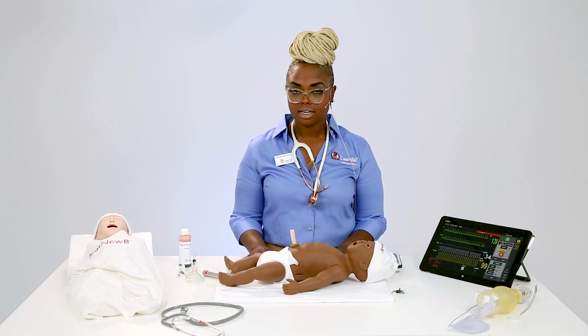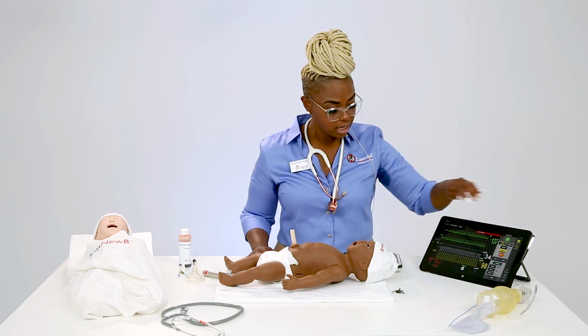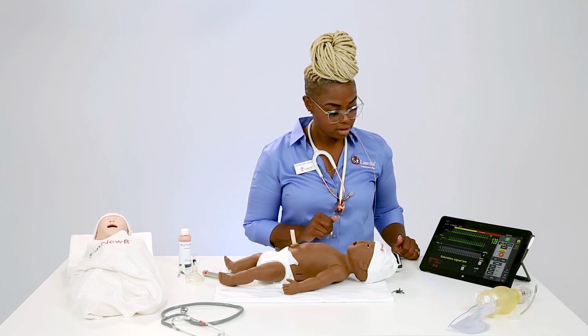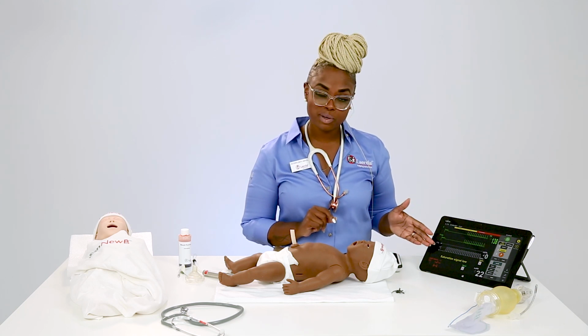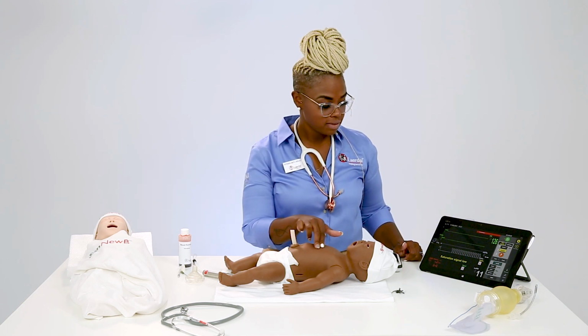Next question I see that came in is, when doing appropriate compressions at the correct depth, do you get a compression wave on the cardiac monitor? That's a good question. I'm going to have to follow up with you, but I do believe that you do. We can, give me 1 second and I can answer that. Let's see. We can do it live right now. As you can see, I've put my patient in asystole, which is bad, but we're going to see if we can get that rhythm.